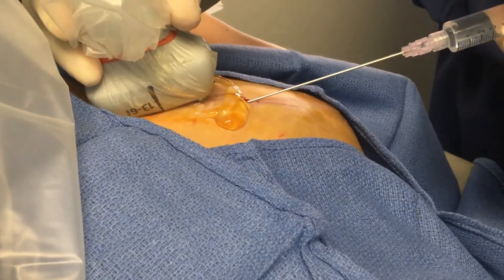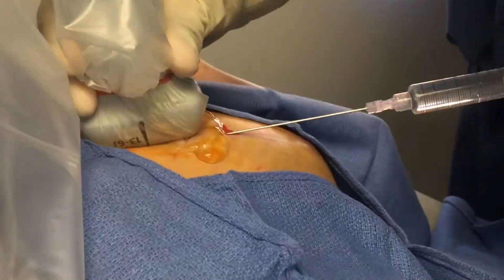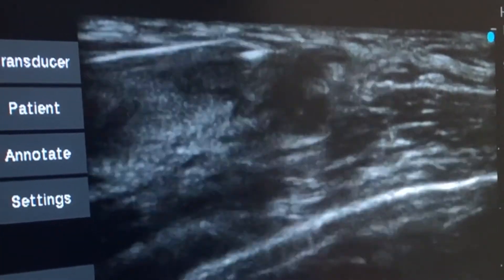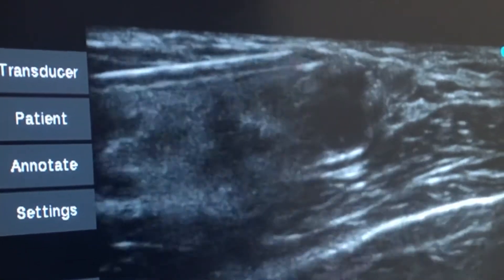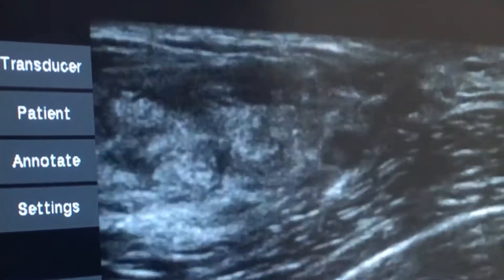A longer needle is introduced through the skin nick and additional local anesthetic is injected into the breast. Now you see the needle appearing as a white line entering the left side of the image and then passing between the skin above and the cancer below. The cancer appears as a dark area at the center of the image. In this moment you see local anesthetic being injected between the skin above and the cancer below.